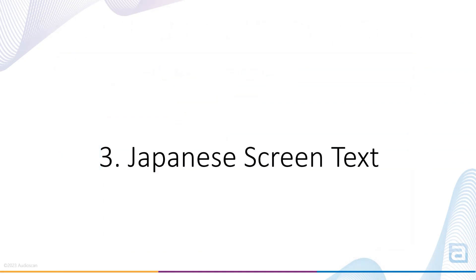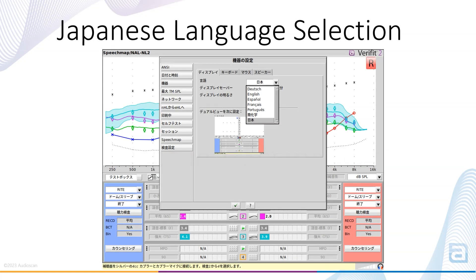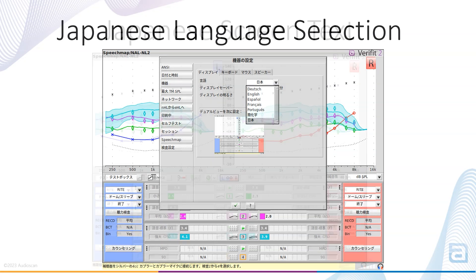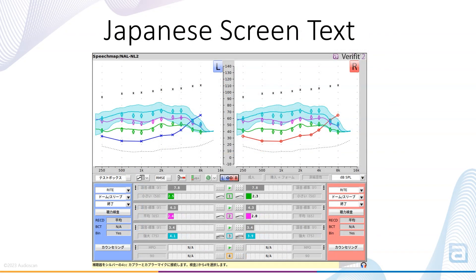We've continued to expand our multi-language support through the addition of Japanese screen text to Verifit 2 and Axiom. Selecting Setup and then Devices allows the selection of screen language. English, German, Spanish, French, Portuguese, simplified Chinese, and now Japanese are available on the Verifit 2 and Axiom. This provides clinicians the comfort of using the Audioscan in their native language. Selecting a new language will require restarting; upon rebooting, all relevant screen text is translated.